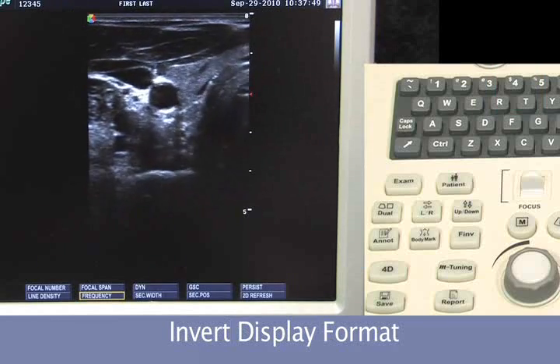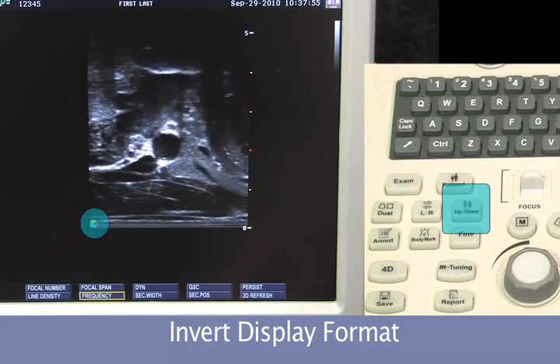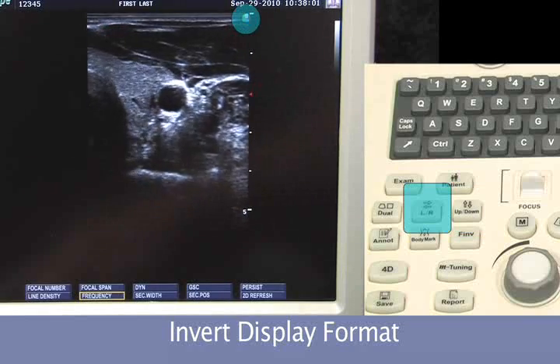Secondary image display formats would be up-down invert, typically used with a cardiac probe when doing pediatric scanning. We can also invert left-right quickly.